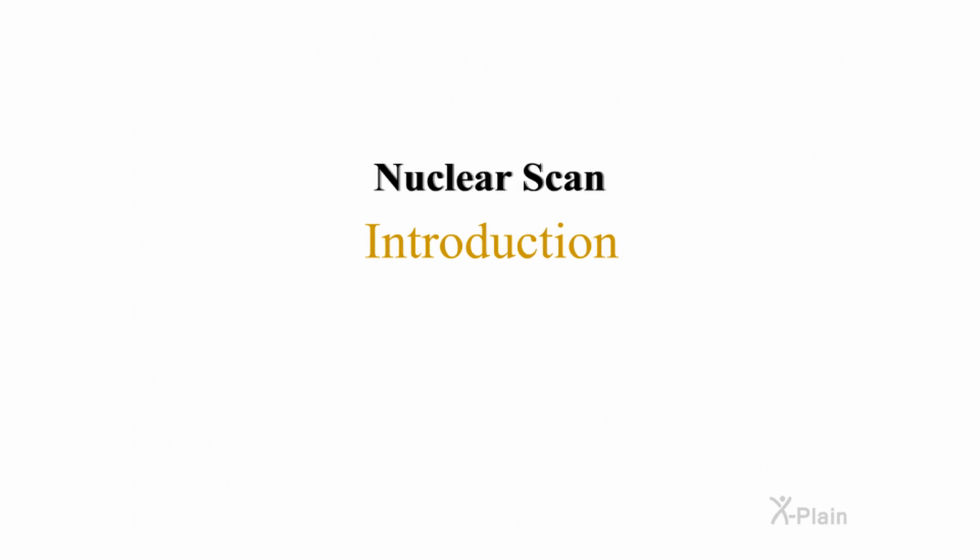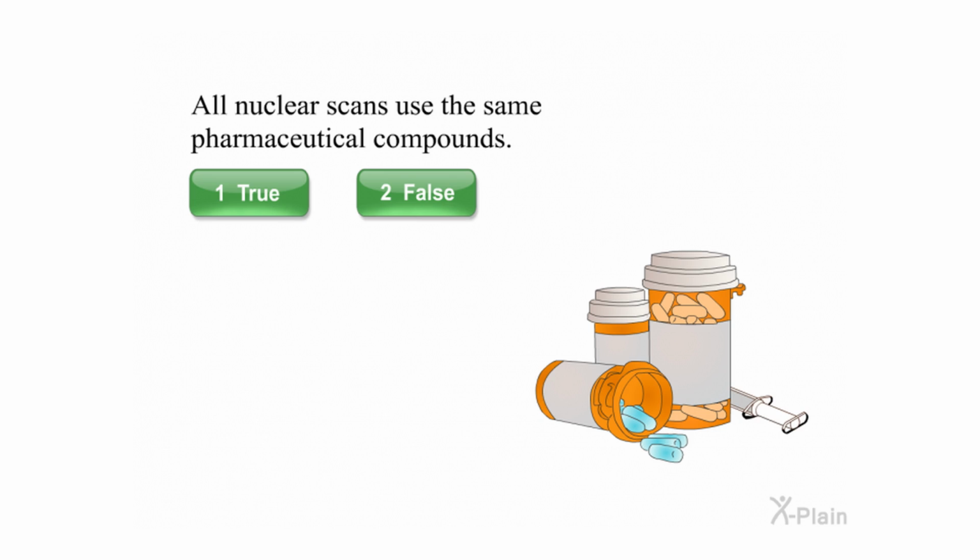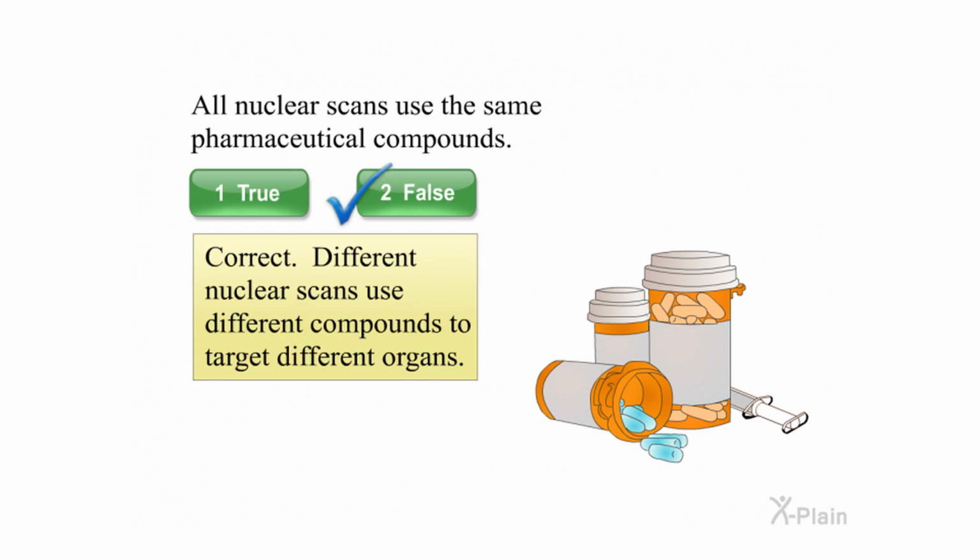Nuclear scan. Introduction. All nuclear scans use the same pharmaceutical compounds. Select true or false. Correct. Different nuclear scans use different compounds to target different organs.